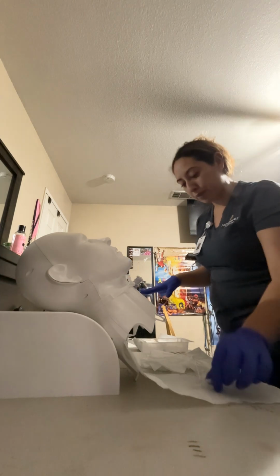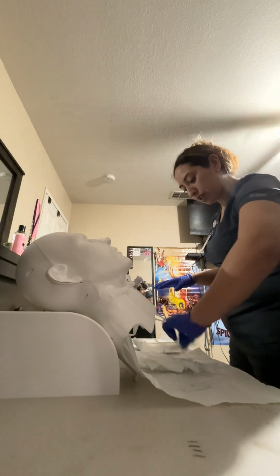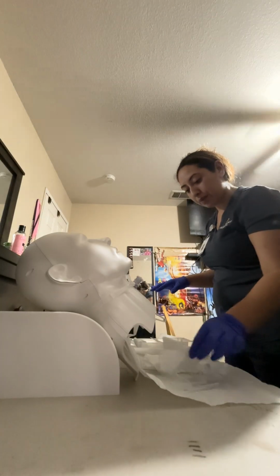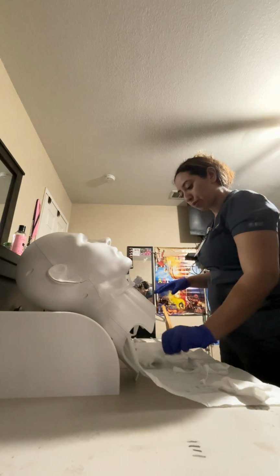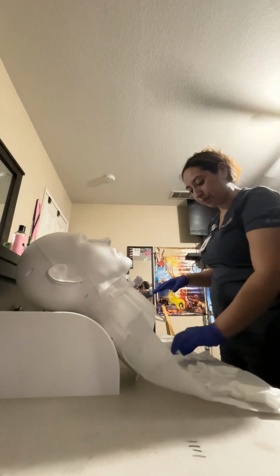So inside I have some pipe cleaners. I have some Q-tips here that I'll use to clean the stoma at a later time. I'm going to place that in a clean soaking bin for later use. I have inside here some 4x4 dry dressings, dry gauze pads. I'm going to separate those. It has included a clean split gauze and new trach ties, along with a bristle brush that I will use to clean the inner cannula.